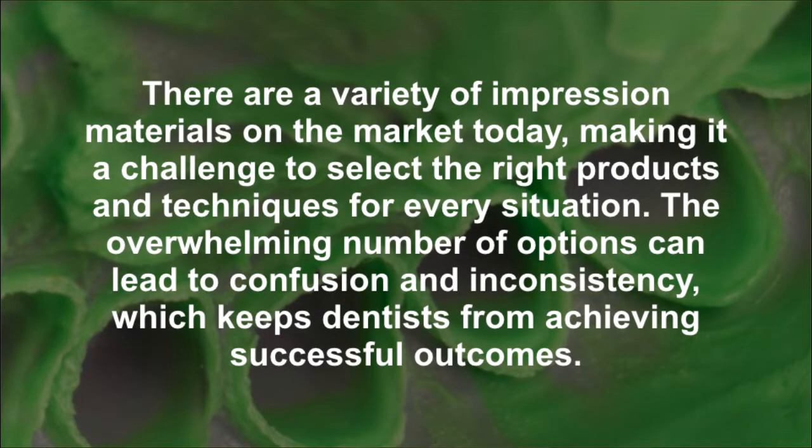There are a lot of variety of impression materials out there on the market today, making it a challenge to select the right ones. But there are so many different types, viscosities, and materials that it's really important for you to understand what you need and the procedure that type of impression material is going to dictate. The overwhelming number of options can lead to confusion and inconsistency, which keeps dentists from achieving successful outcomes.